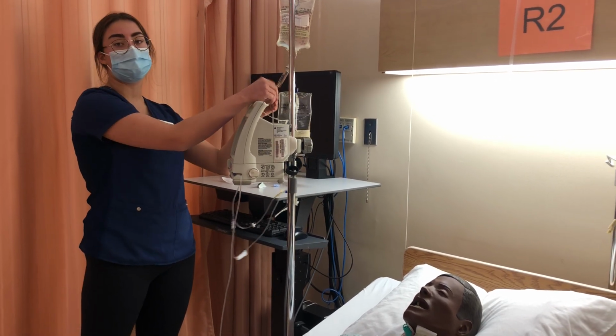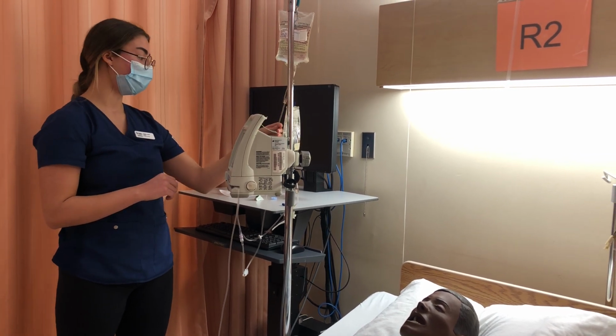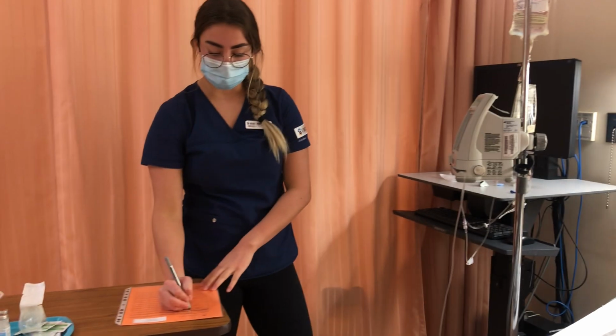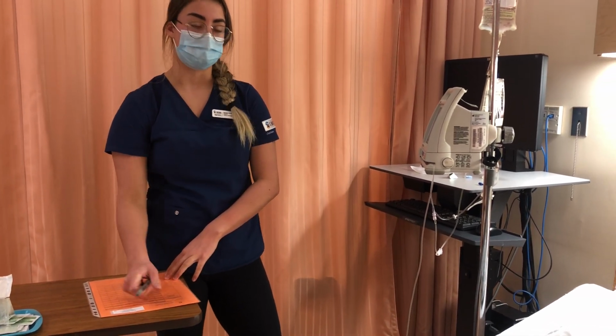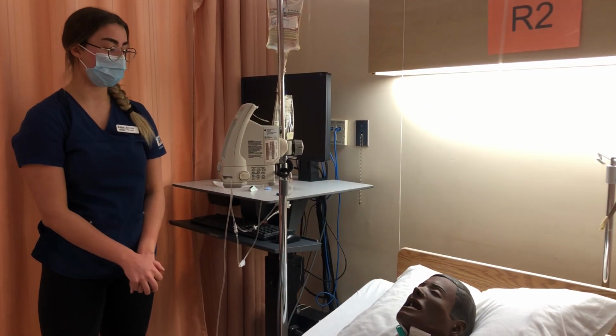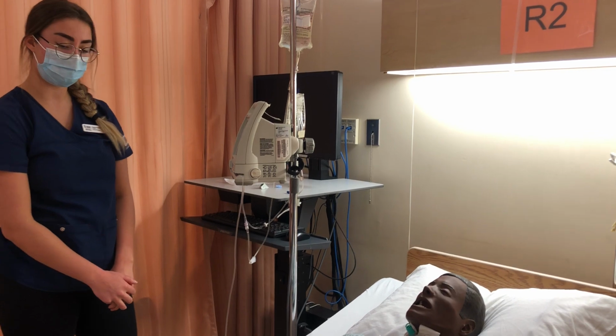I'm just going to label my tubing for the next nurse so they know when to change it. And I'm going to sign the MAR with the date, well the date's here, the time, and my signature and designation to state that I've given the medication. Do you have any more questions for me, Benicio? They say no. Okay, great.